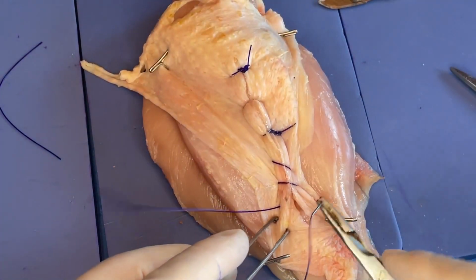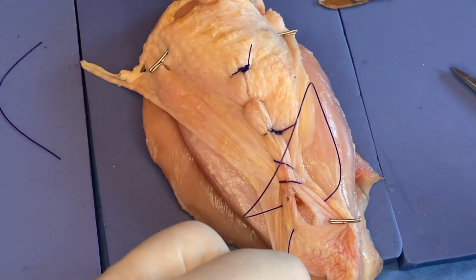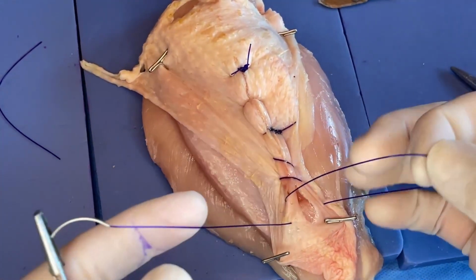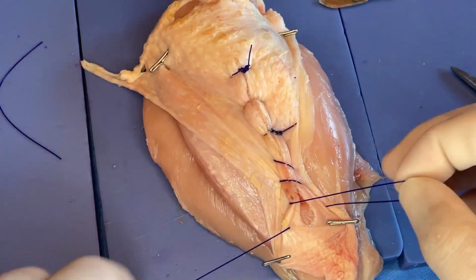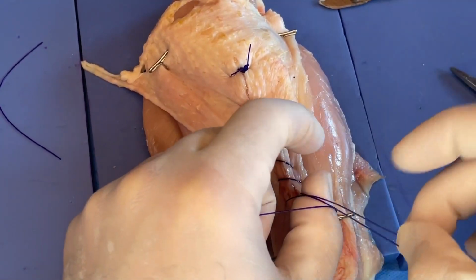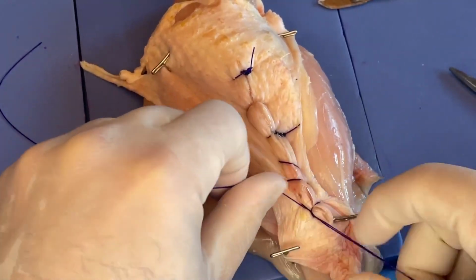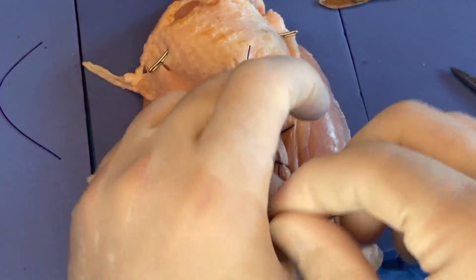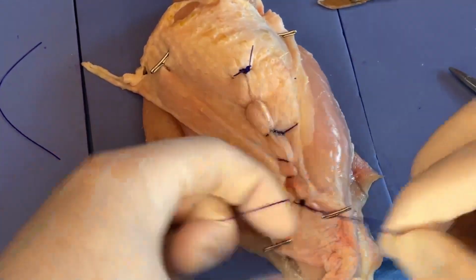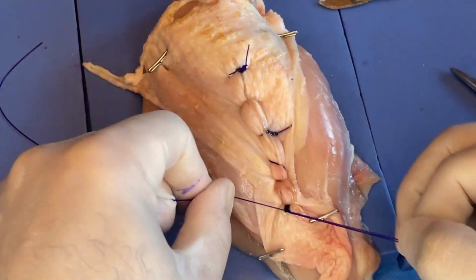All right, so let's say we're going to tie this next one. We're down at the end of our defect. So this is a little bit of a challenge because we've got 3 strands, 2 strands in our loop, and then the single strand. So it just makes for an even bigger knot. But again, we treat our loop as kind of a single strand over the thumb, cinch that down nicely, and then finger, thumb, finger, thumb.